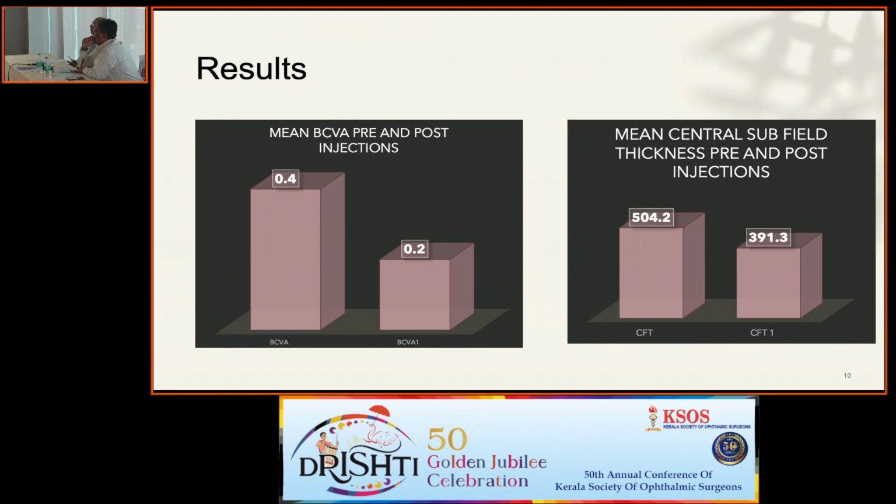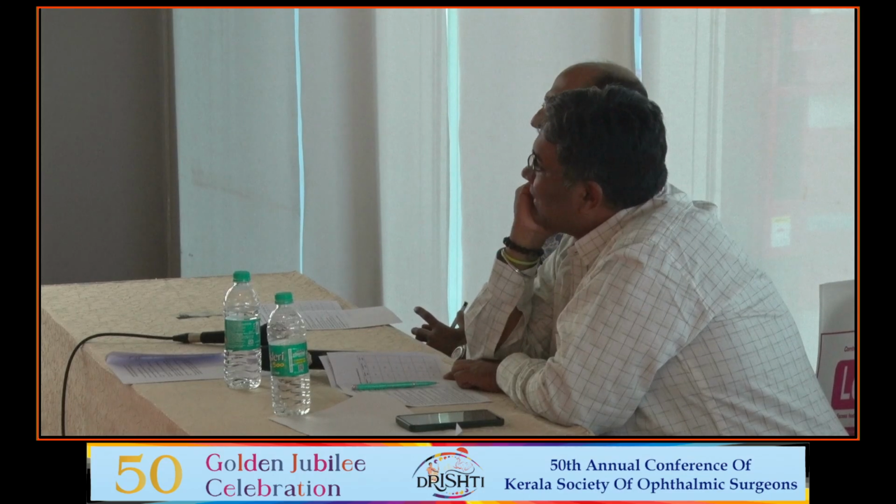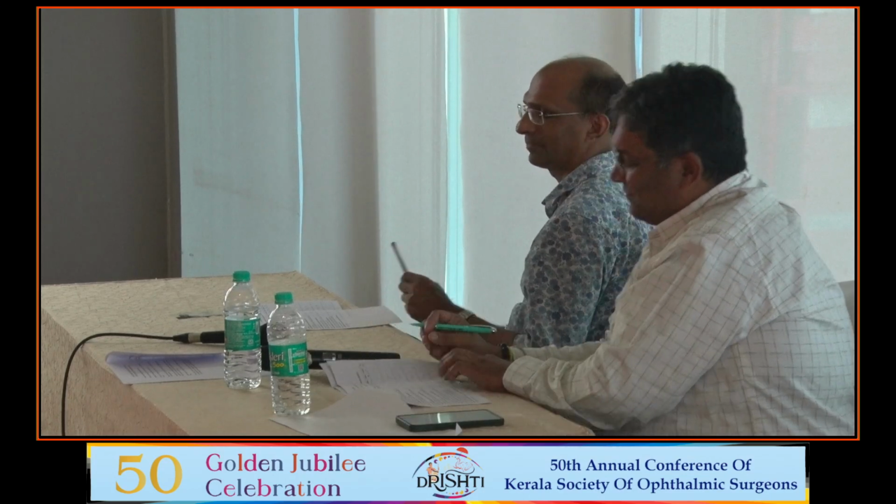We have used OCT angiography because in FFA we can delineate only the superficial capillary plexus. In OCT angiography, both superficial and deep capillary plexus can be delineated. Thank you.